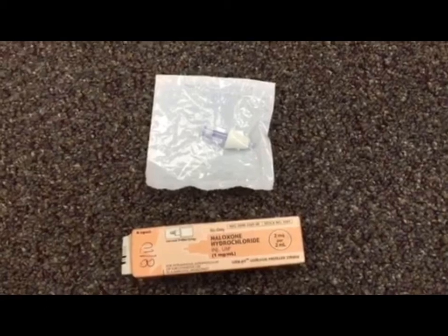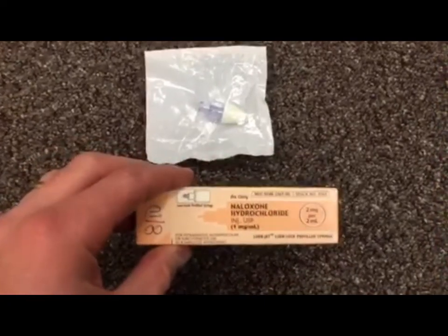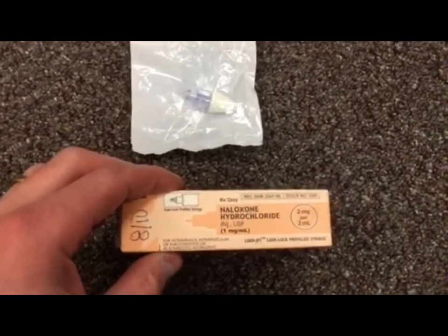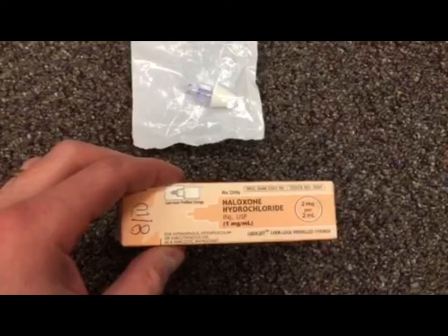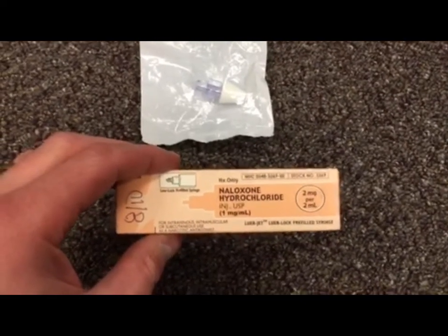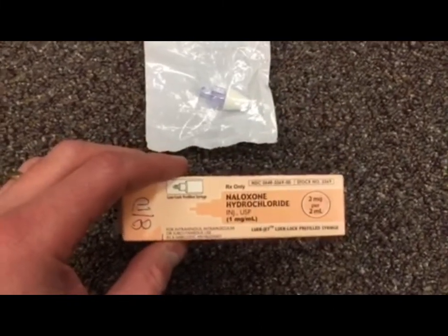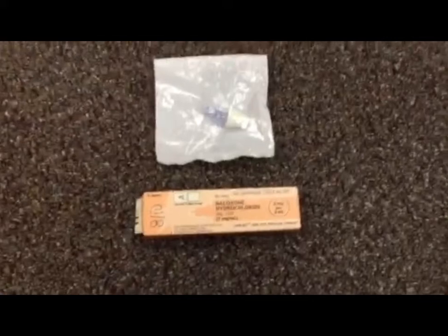Okay, this is our MAD device you see here. It comes packaged here, ready for use. This is how our Narcan or naloxone is supplied. We have a syringe here that has 1 milligram per milliliter concentration. It contains 2 milliliters of medication, so each milliliter has 1 milligram. So we have one milliliter for each nostril here.